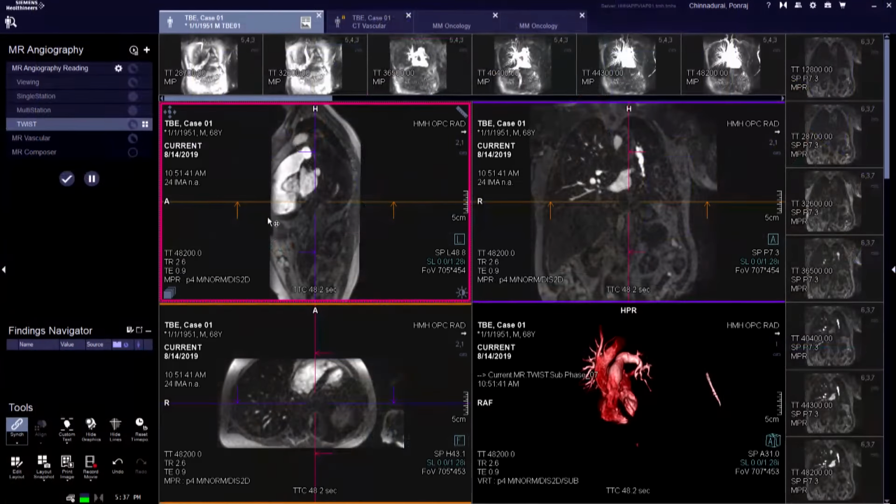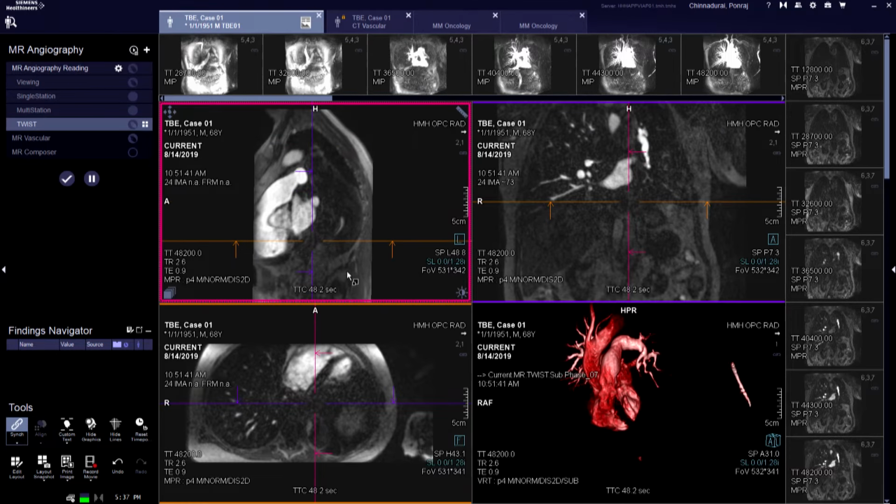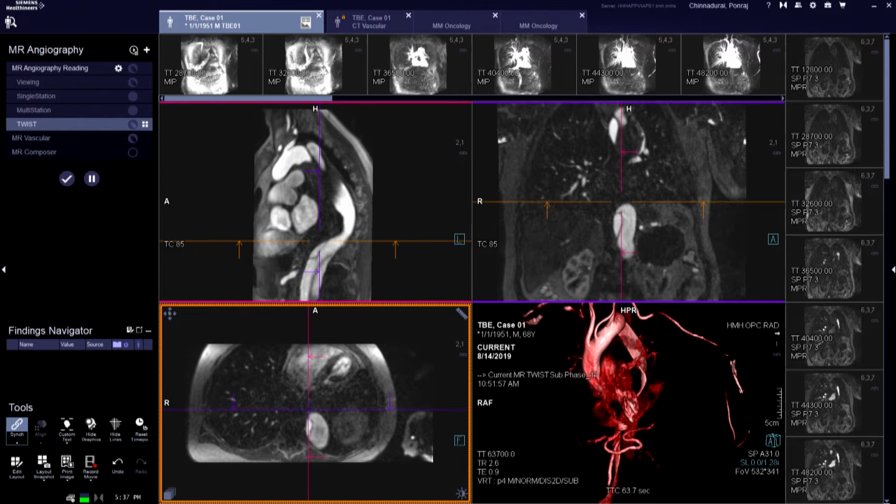I'm glad you mentioned it, because I prepared a case for that. This patient actually got an MR, and this is the MR of that patient. So again, one good thing with MR is it's dynamic. This is the same aneurysm of that patient, the dissection of the patient. Here what I'm going through is stepping through different time points. And here you can see the contrast is in the pulmonary artery. And as I am fast forwarding.